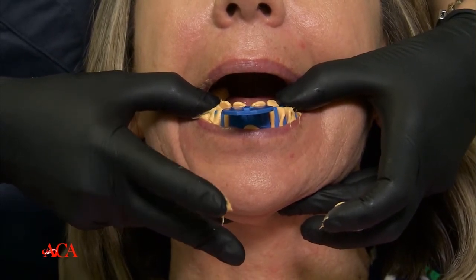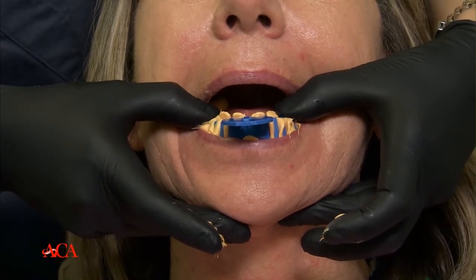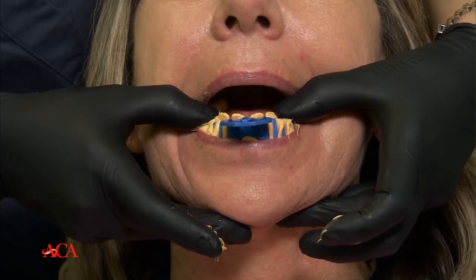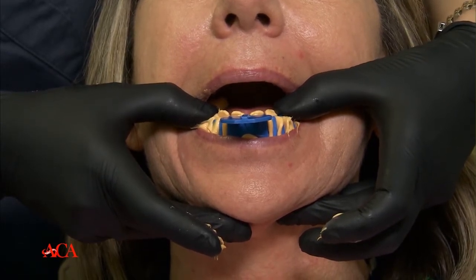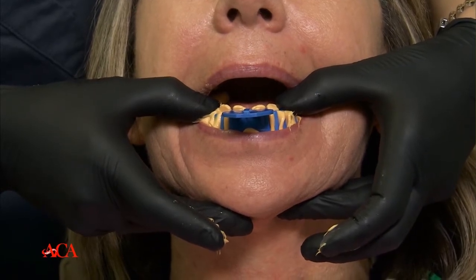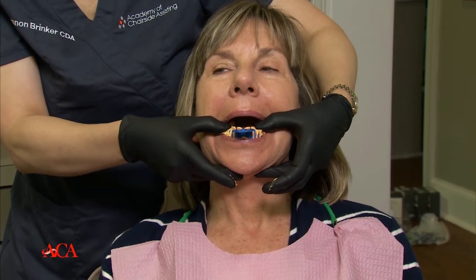A lot of assistants will stand in front the whole time, and that's fine, because if you're worried about moving, you can move the tray. But for me, I like it better where I can put my hands around her chin and actually hold it stable here. So again, I think it's just a matter of technique. But this is going to be a minute working time, minute and a half setting time.